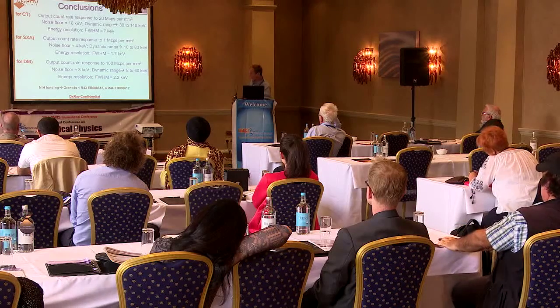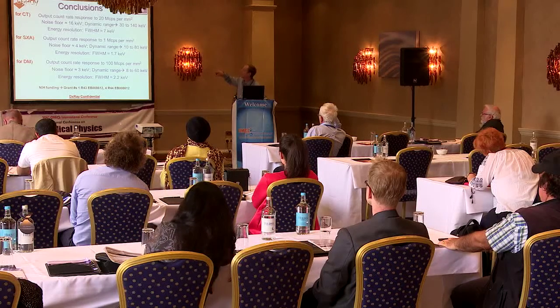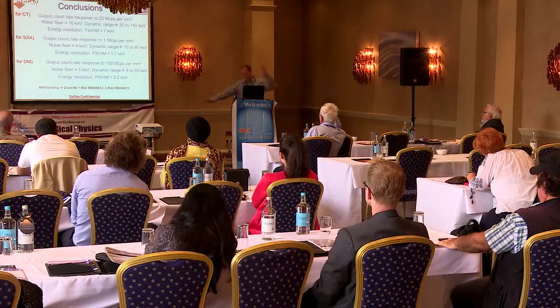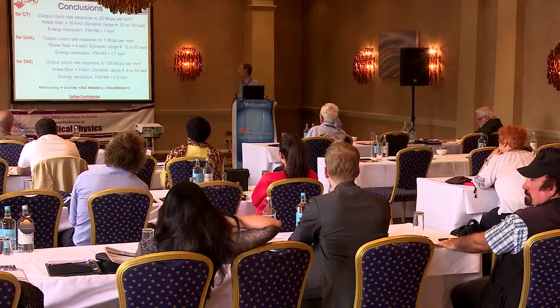For spectral X-ray absorptiometry, we obtain 1 million counts per second per square millimeter, a noise floor of 4 keV, a dynamic range between 10 and 80 keV. This again satisfies the need for this clinical dynamic range for these clinical scans, and an energy resolution of 1.7 keV.